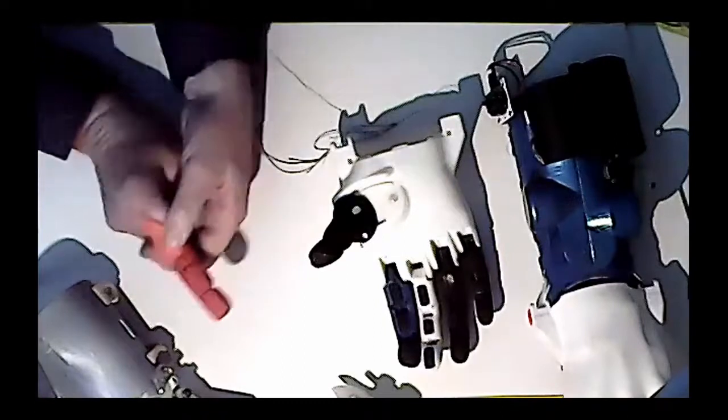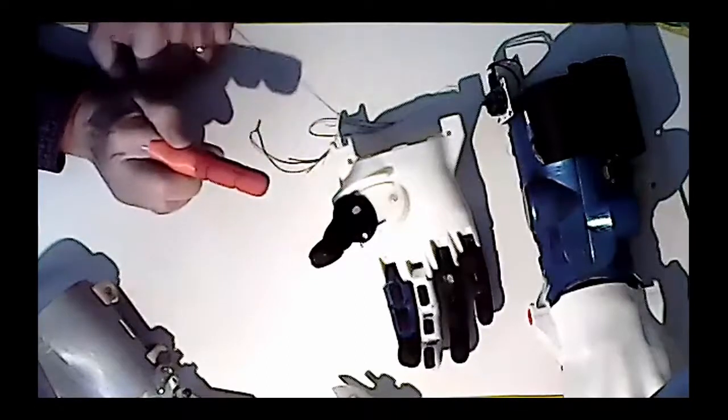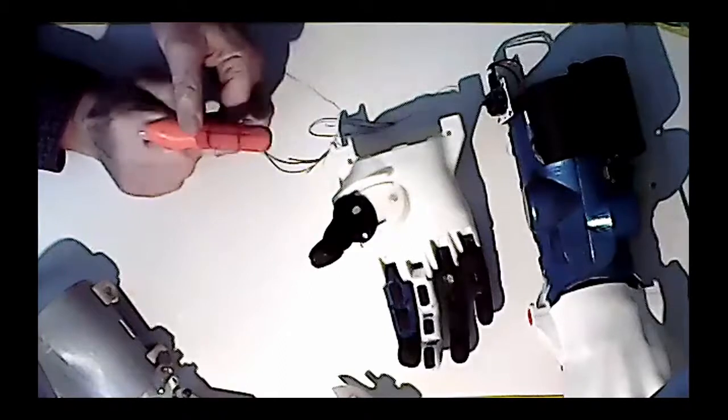This is an attempt to be plugged onto one finger of Natalie. The concept is not finished. In fact, it works, except that it doesn't stay on the finger, so it doesn't work. The kinematics is working well, but it doesn't stick correctly on the forefinger. So we have to find a solution.